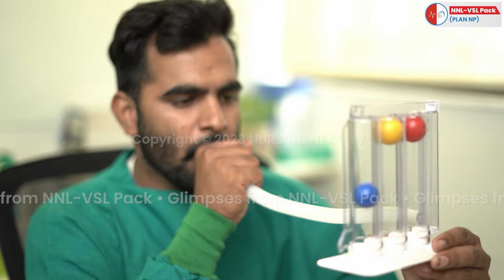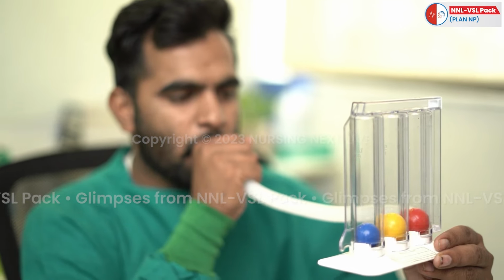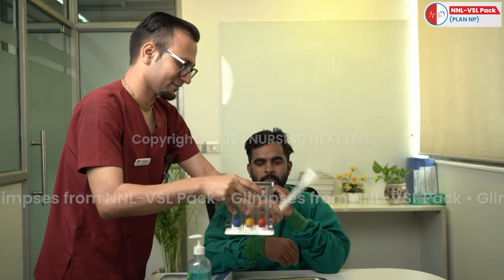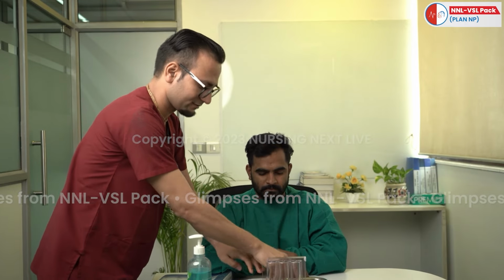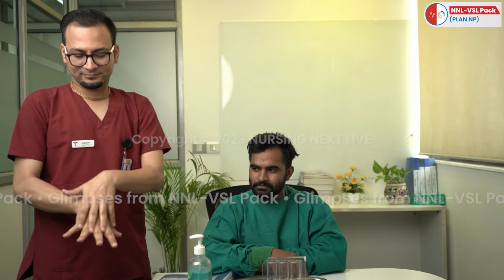The next step is a slow inhalation to raise the ball, flow oriented or volume oriented in the chamber to the set target. At maximum inhalation followed by breath hold and normal exhalation. Aftercare. Wash hands. Record procedure in nurse's note.